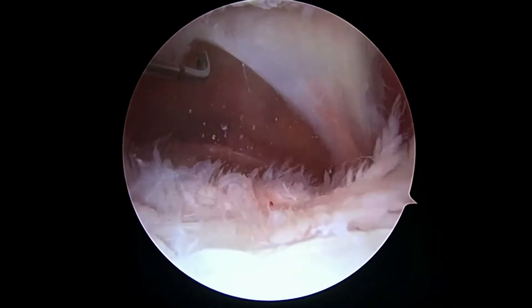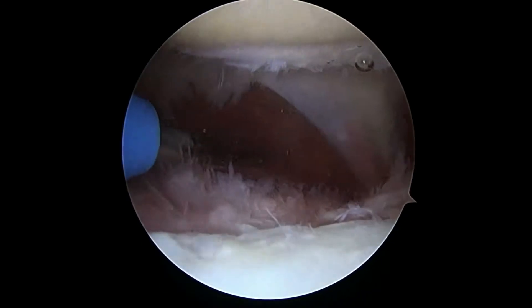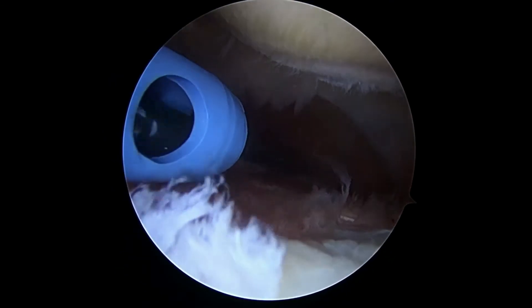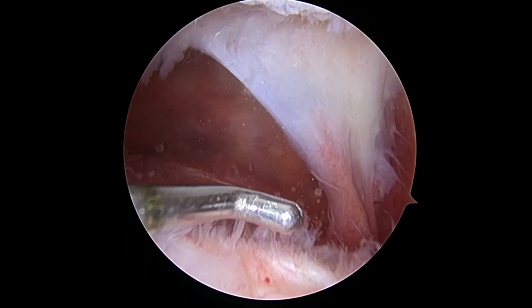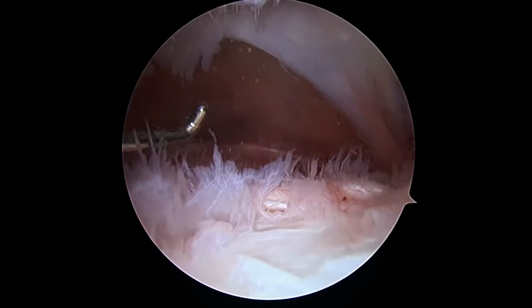All right, Stephen. So this is Dr. Eisenberg here with the team looking inside your knee. We're just getting started here. The first thing we looked at — I'm going to get some of this flow going. On the left, you see a blue cannula. That hole inside the cannula is about three millimeters wide, or an eighth of an inch. The tip of that probe I have here is only one millimeter in thickness and three millimeters long, just to give you a little bit of an idea as far as the magnification.